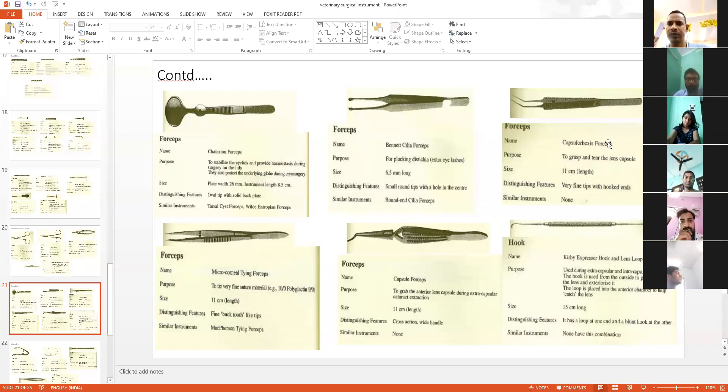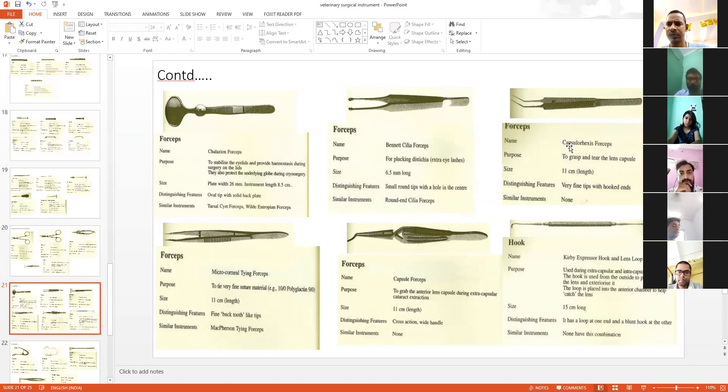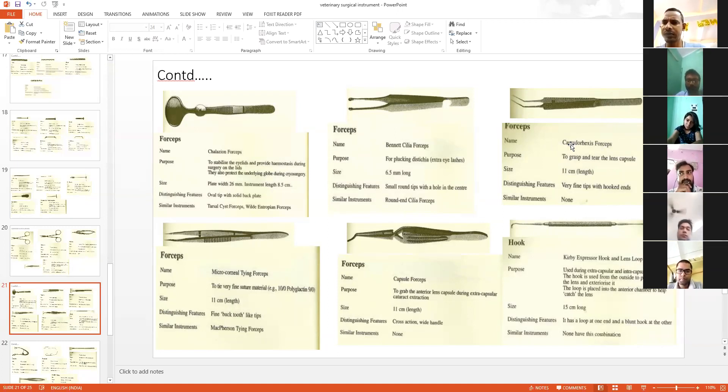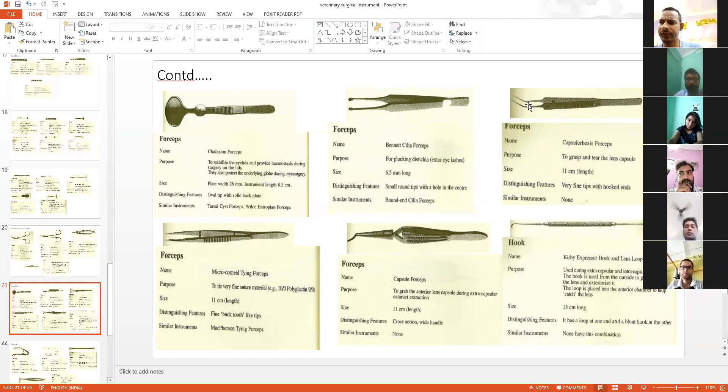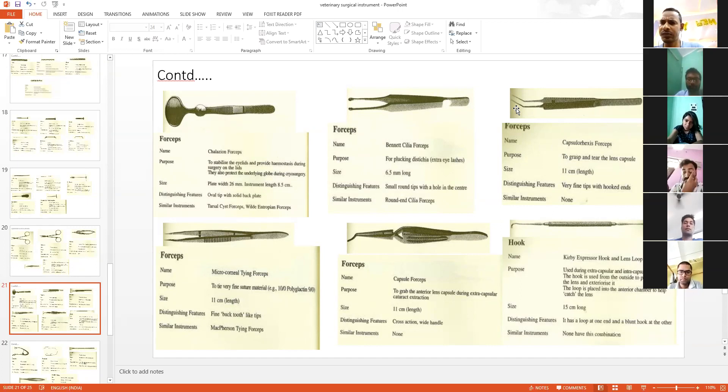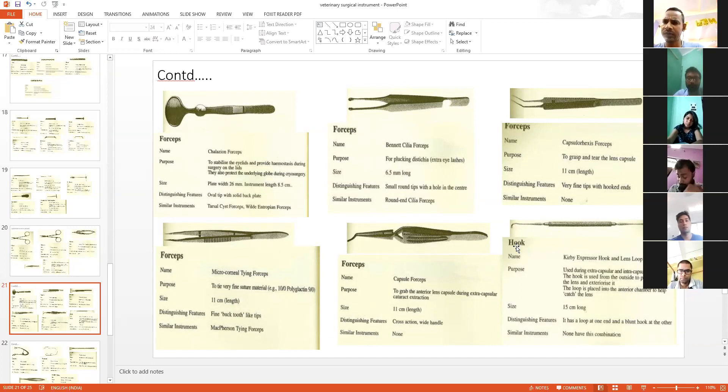And this is capsulorexis forceps. This is for the removal of the capsule. This instrument is used for capsulorexis of the lens.